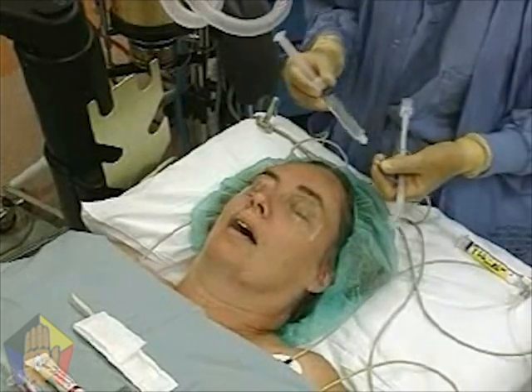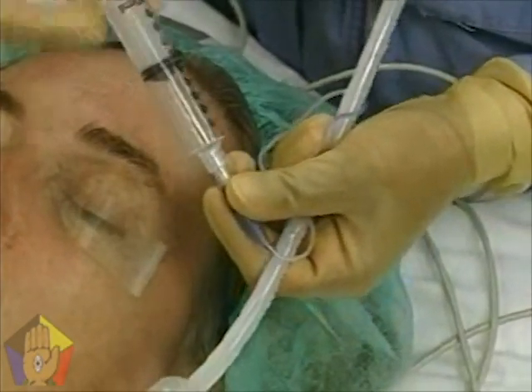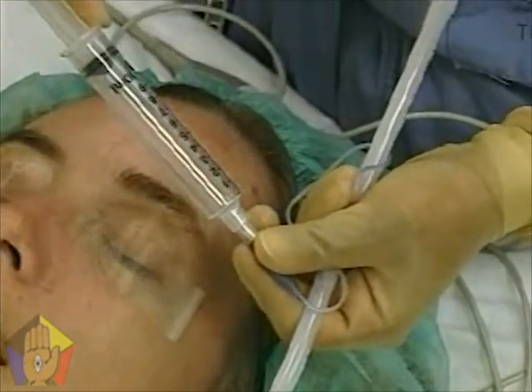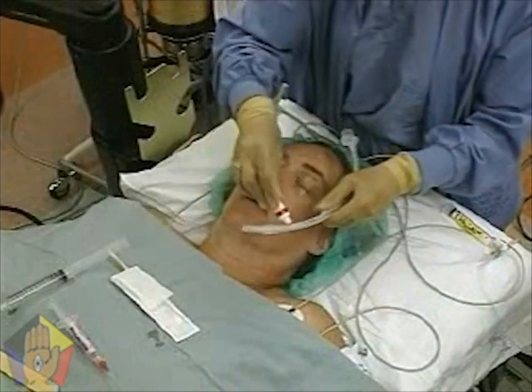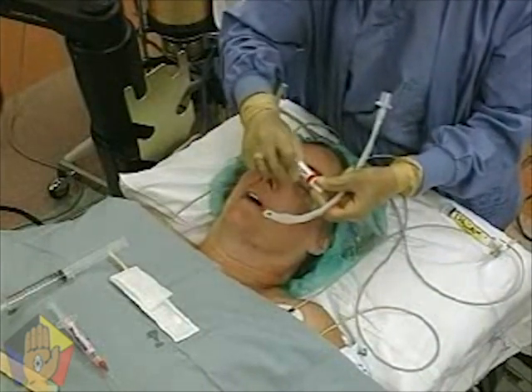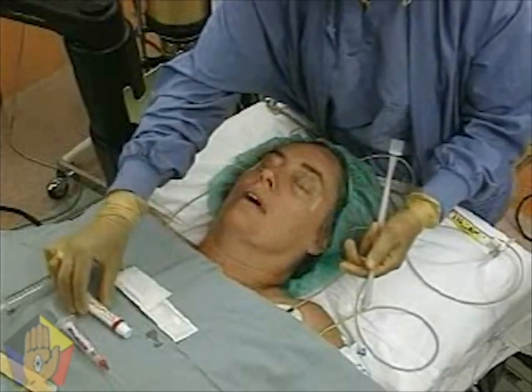Check the endotracheal tube cuff for leaks by inflating and deflating the balloon with 10 milliliters of air. Coat the end and cuff of the unstyletted tube with viscous lidocaine jelly. If warm saline is available, the tube may first be soaked for three minutes and then the procedure is performed.